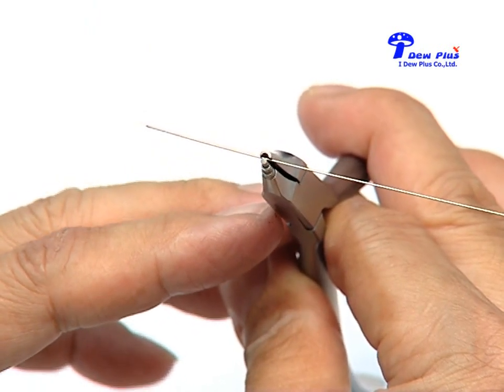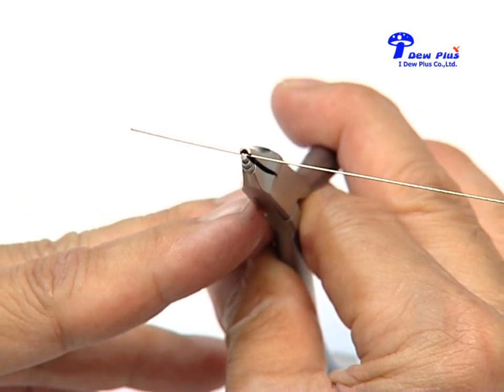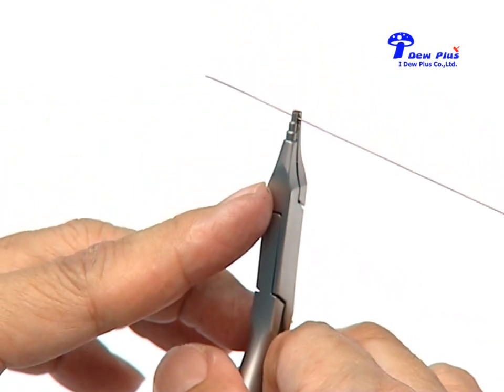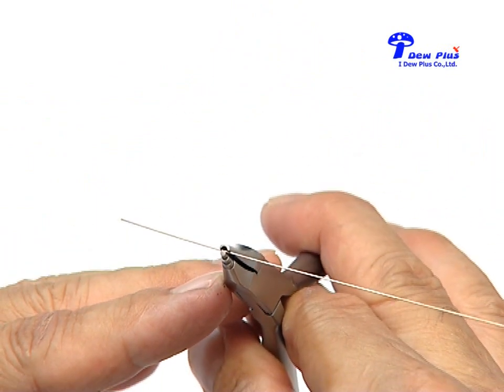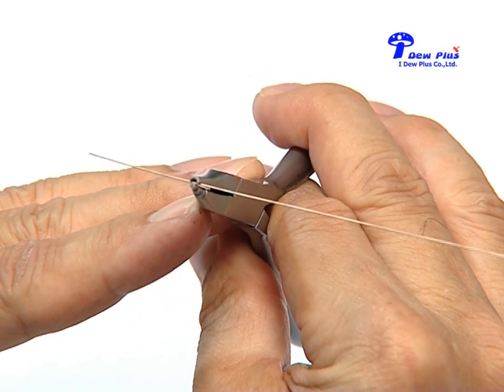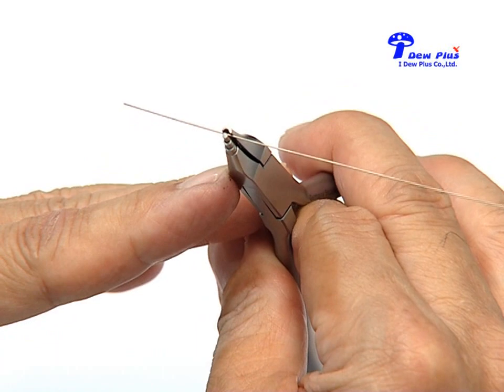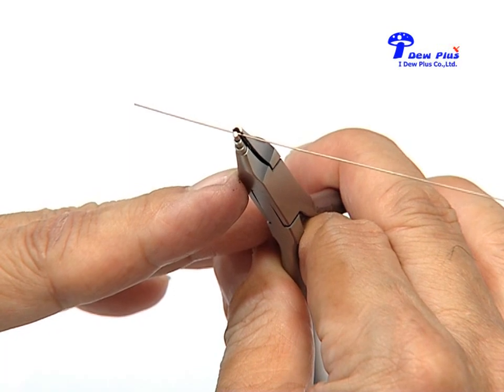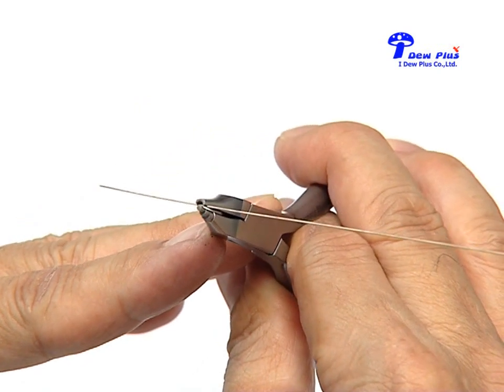This is the Tweed loop bending plier. It has 2 beaks together. One beak is a round beak and it has 3 steps. The step we use is the top one. Another beak is a half round beak. If we want the tie back loop gingivally placed, we need to place the round beak just opposite the loop, that is down position. The loop is up and the round beak is down, always on the opposite side.